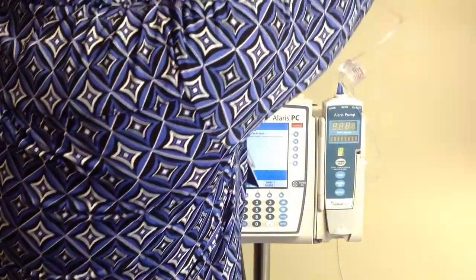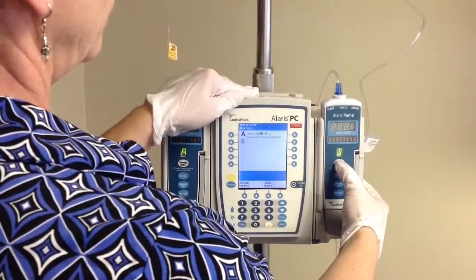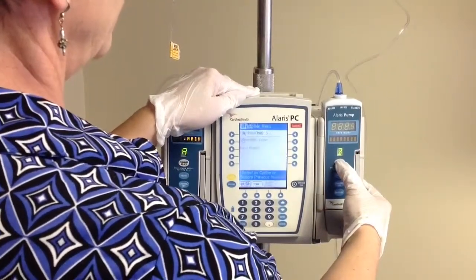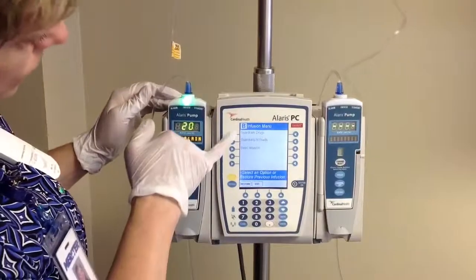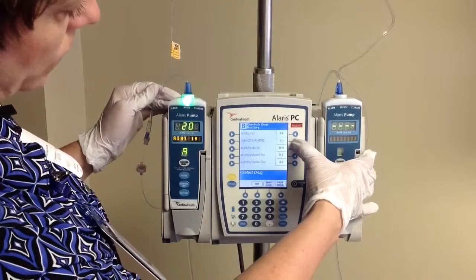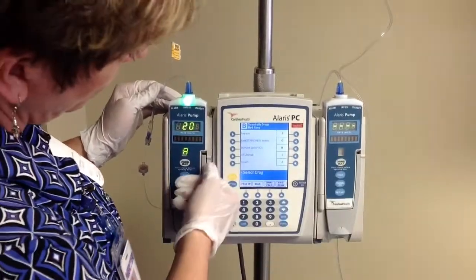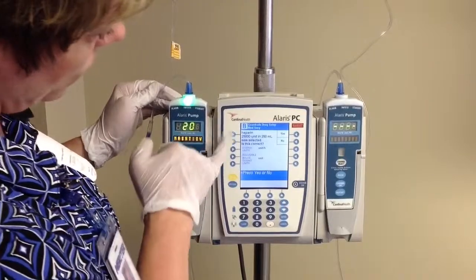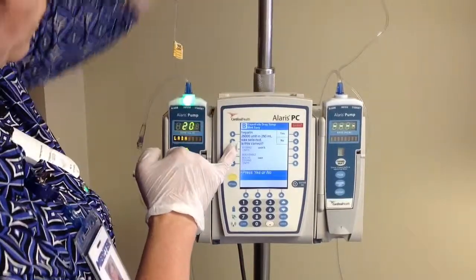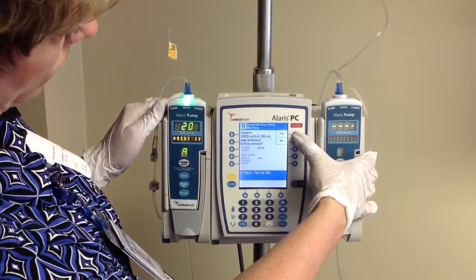So we're going to hang our heparin, and now we're going to start programming our pump. Talking to the channel, do channel select, and this time rather than fluids we're going to use guardrail drugs. Choosing from the menu using the alphabet on the right-hand side, we can get down to H and grab our heparin, which is the top option. We're just confirming that this is the concentration that was on our bag — the 25,000 units and 250 mils — and hit yes.